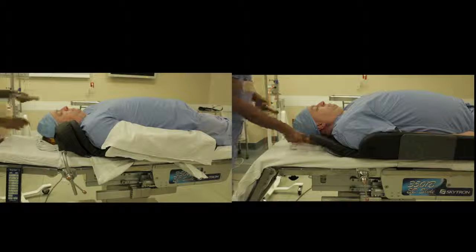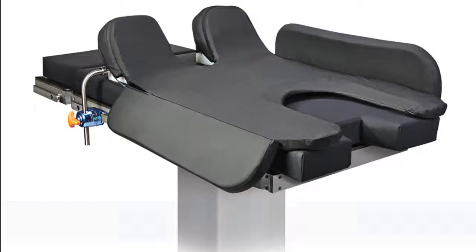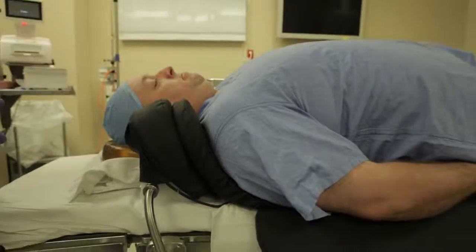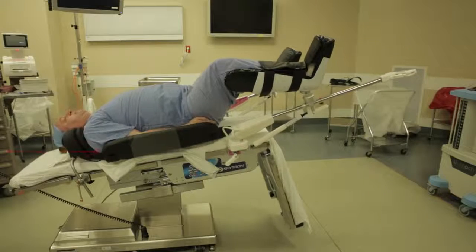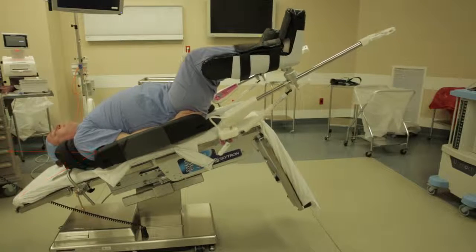SecureFit allows convenient intubation with or without wedges in place, depending on the preference of the anesthesiologist. The gel pad cradles the patient through the scapula region, redistributing pressure over the entire area of the scapula, avoiding injury to the brachial plexus, and helping to prevent pressure ulcers. It also serves to keep the patient secure in steep Trendelenburg.